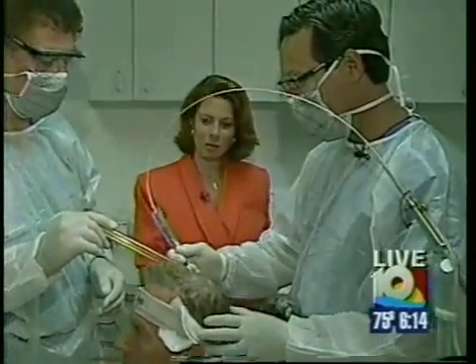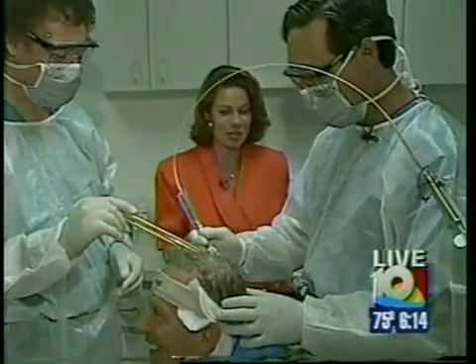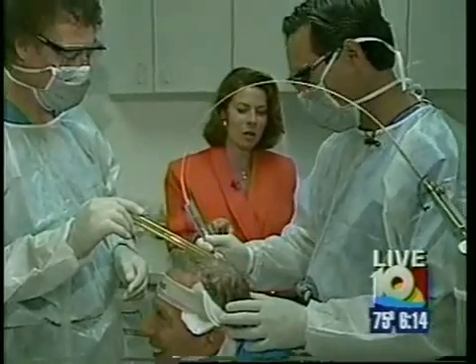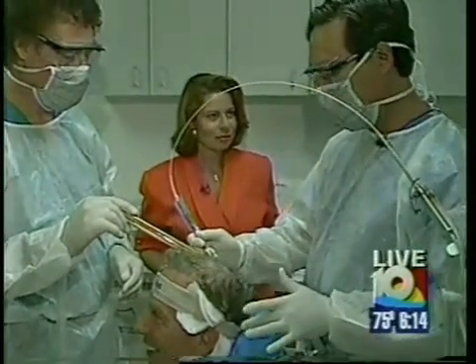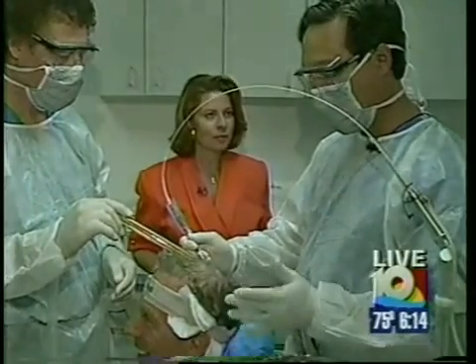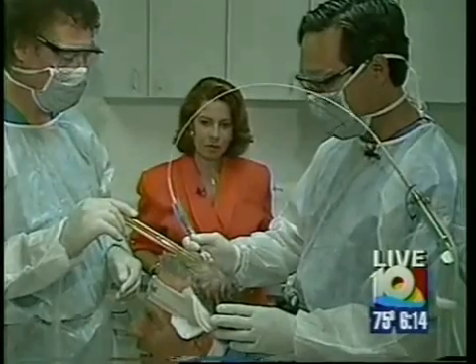And our patient is so quiet. We're going to talk to him in a few minutes and find out why he chose this way. But yeah, no more scalpel. That's what I noticed. Right, no more scalpel on the top. We'll still use it in the back to take the strip out, but it has really made the whole process so much easier for the patient.